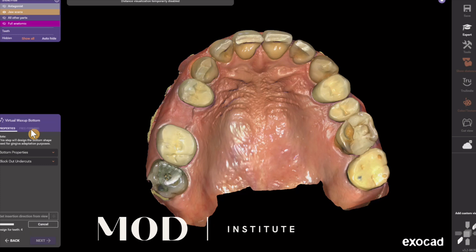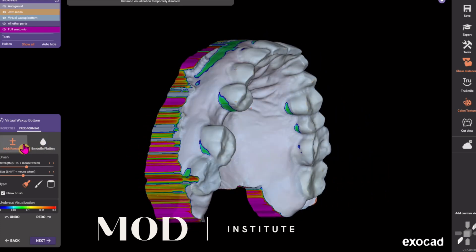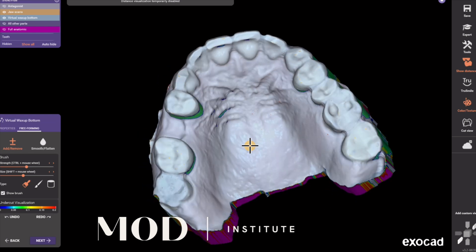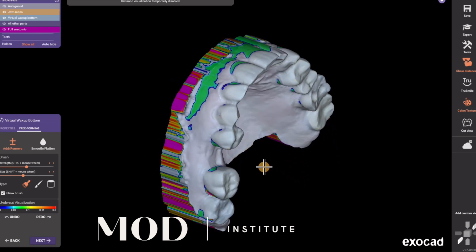Hit apply so that it generates the virtual wax-up bottom, which is that new baby blue model that you'll see pop up on the screen. People don't realize that this blue model — the virtual wax-up bottom — is really what determines the fit and retention of the partial denture. Hit apply, then go to free form, which defaults to the add/remove tool. Hold shift to remove, and remove block out wax where you want to engage your clasp tips.